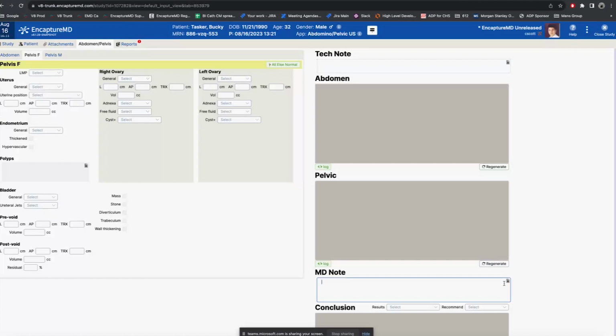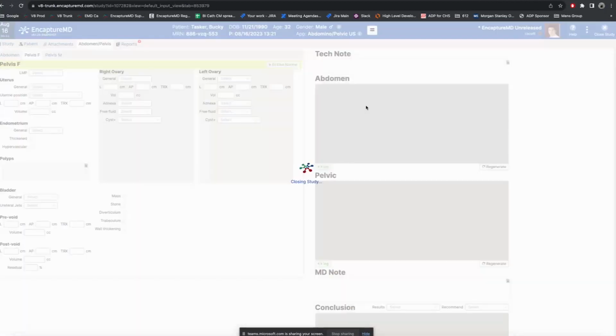And so we can provide that level of flexibility and control of the output display in a very uniform and attractive way that is highly communicative of the result that you want to be able to send back.